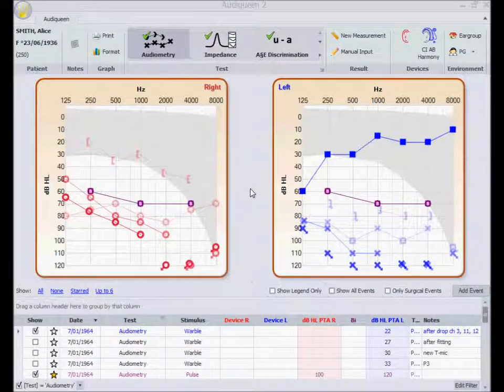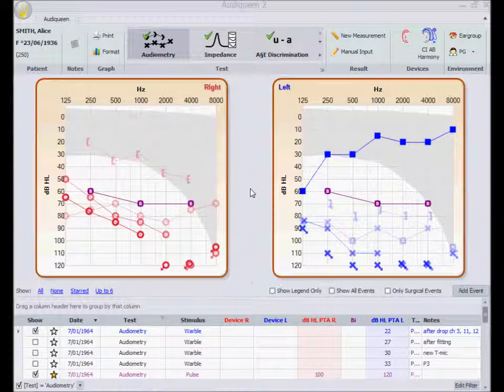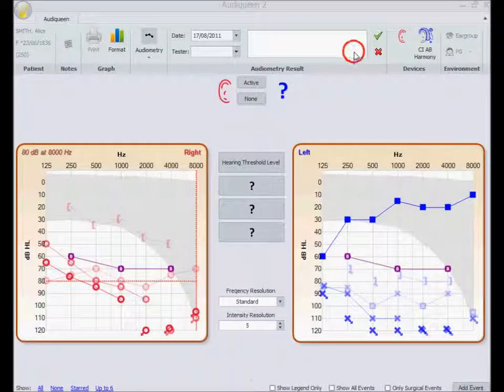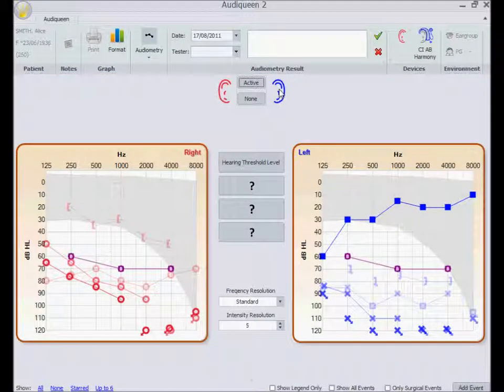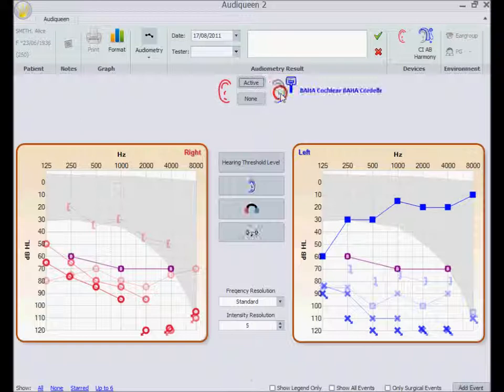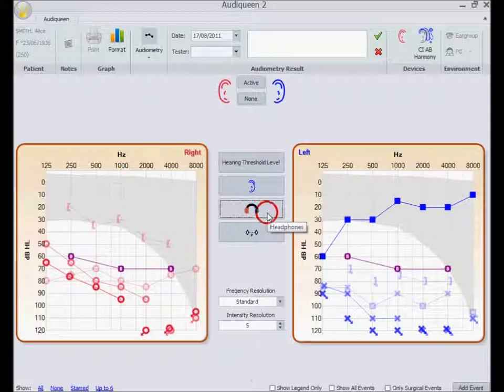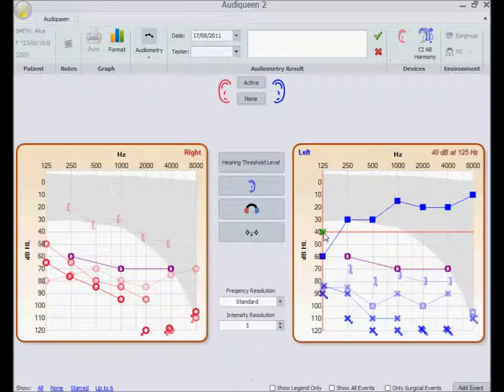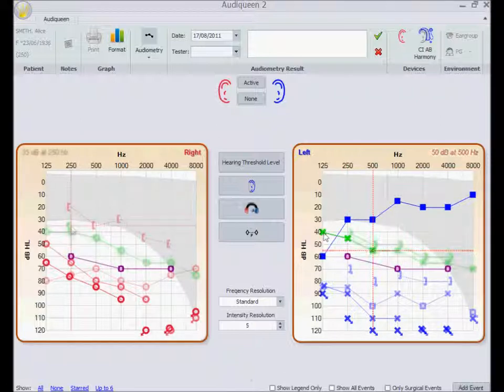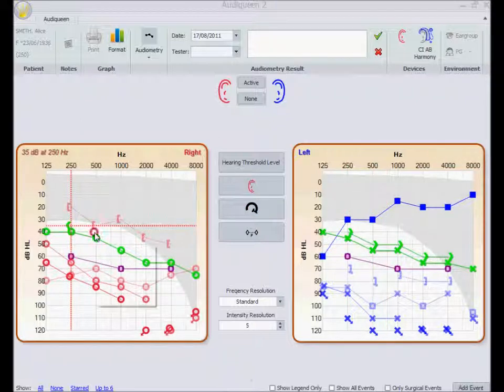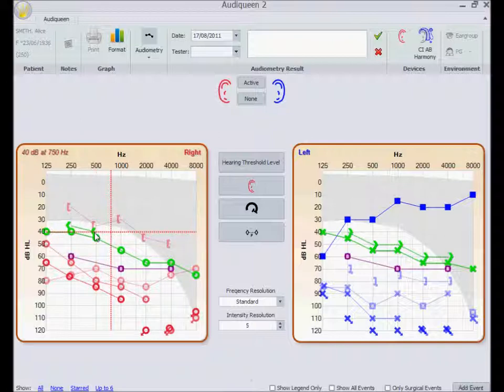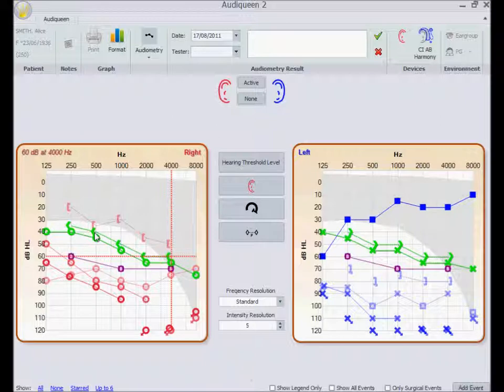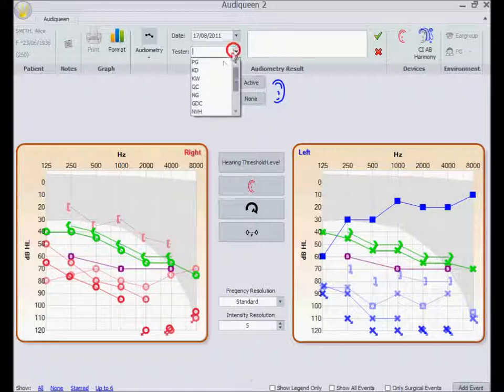Okay, now the big question: how do all these results get into Audiqueen? Well, this is really the easy part. Let's take the audiogram. One way to introduce new data is the manual input. I first select the condition of the ears, aided or unaided. Let's simulate a test without hearing aids and by means of a headphone. I just plot the thresholds on the graph and save the result.